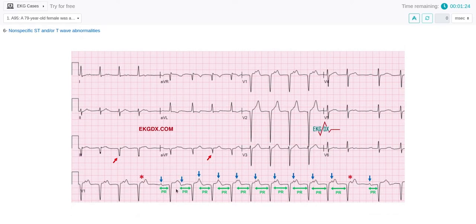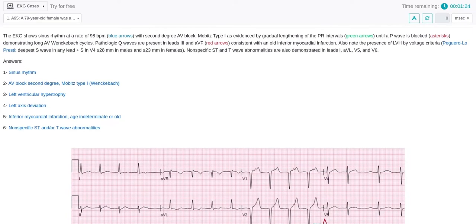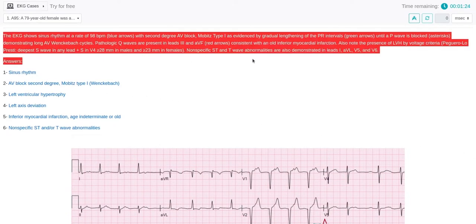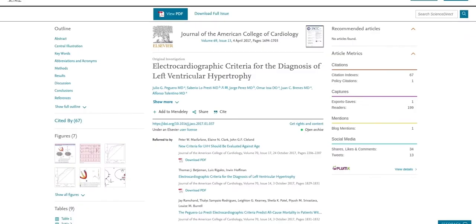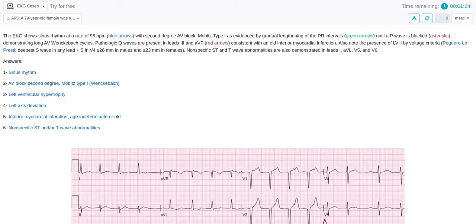Among other things, note the gradual lengthening of the PR intervals. See the green arrows until a P wave is blocked. See the red asterisks demonstrating long AV Wenckebach cycles. Above the EKG, you can find the discussion with the correct answers. In each case, you can review the list of references for each answer. Each scientific article can be consulted at any time, which allows you to reinforce and increase your knowledge with the reading of high-value scientific content.